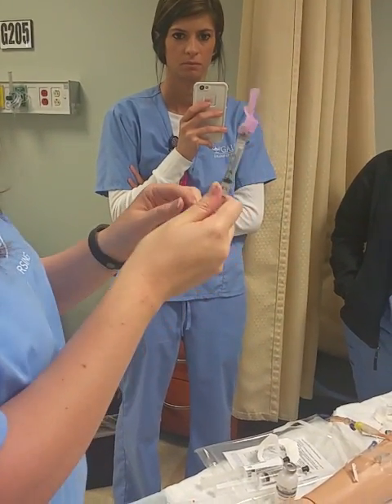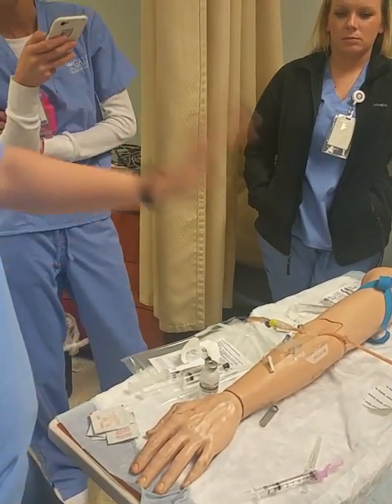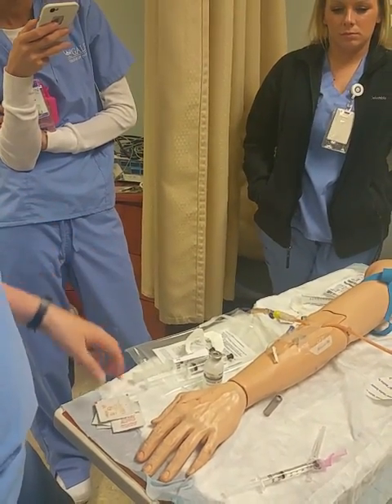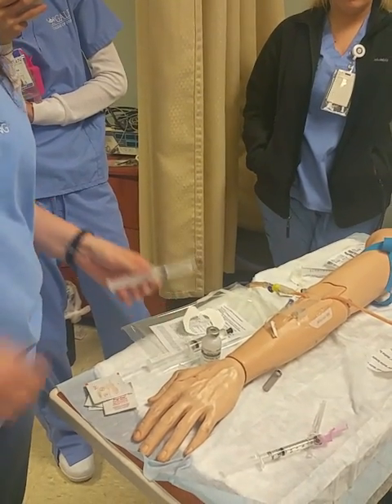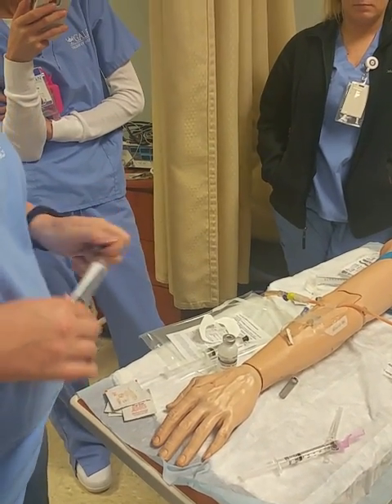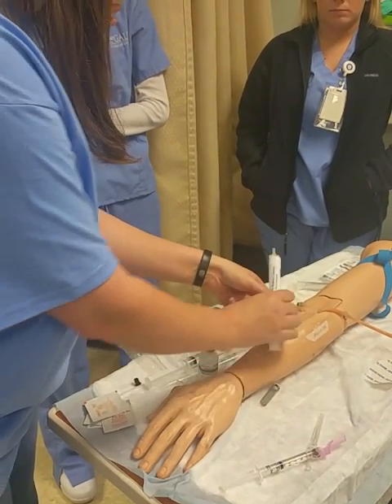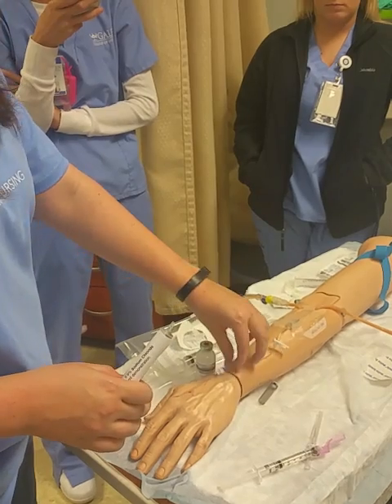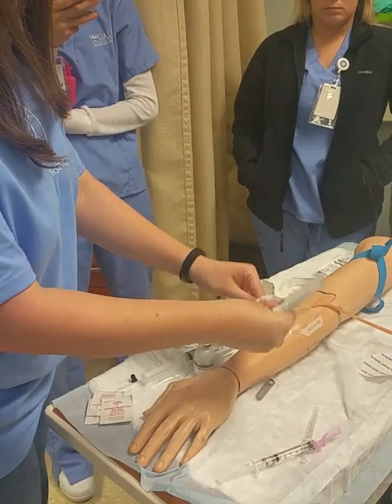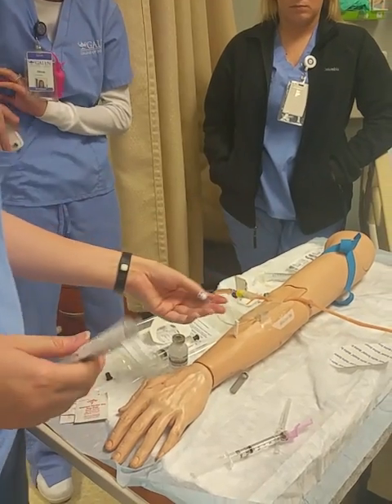Okay. All right. So in the patient's room, I'm going to assess my IV site first. Make sure it still looks good. There's no swelling, there's no bruising or anything like that. I want to flush it to make sure that it's actually going to work before I put my medication in. So I am going to disconnect the tape so that I can have some room. Clean the top, let it dry.